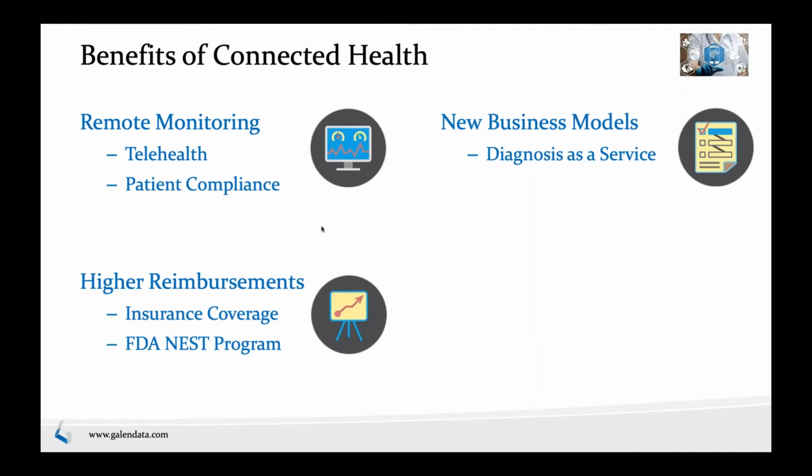You use technologies like your smartphone to move some of the samples, like image-based samples, for example, back into the cloud where the algorithm could be running and doing some of that diagnosis. We have some customers who already use this model. In this case, they are still lab-driven, but the standard lab or clinical instruments produce data, and the data is then moved to the cloud where the algorithms are used to create the diagnostic reports or results, and then they're sent back to either the clinicians, patients, or the laboratory. So you can use that as a different service model than the traditional service model you have with the basic devices in the field.